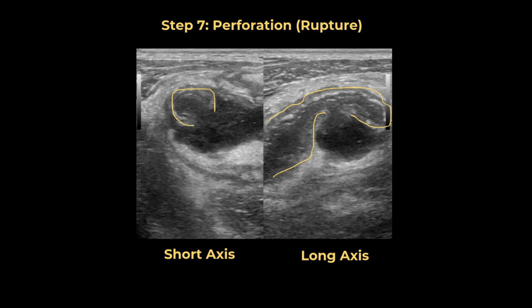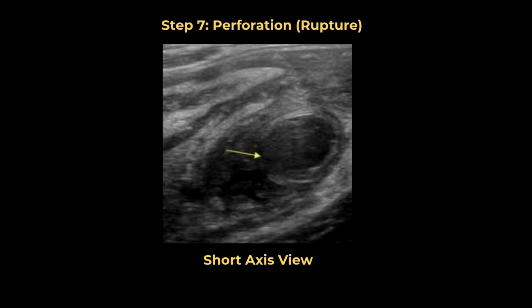You may see loculated free fluid near the appendix or in the pouch of Douglas. This fluid may be simple or complex and represents spilled pus. Extraluminal gas may be seen as bright white spots in the surrounding fat. These produce dirty acoustic shadowing. If an appendicolith is seen outside the appendix within the fat, this is definitive proof of perforation.